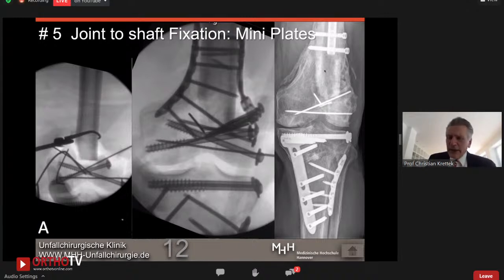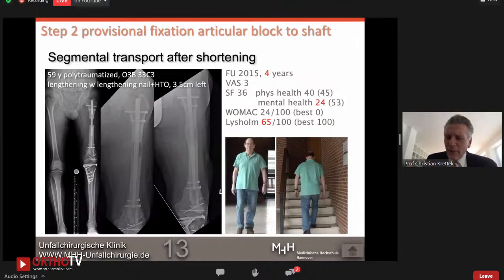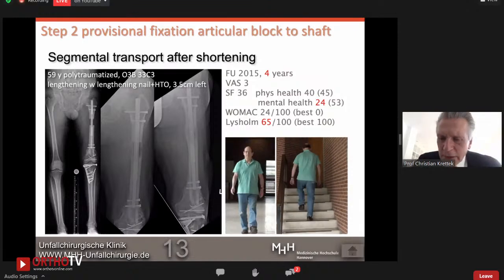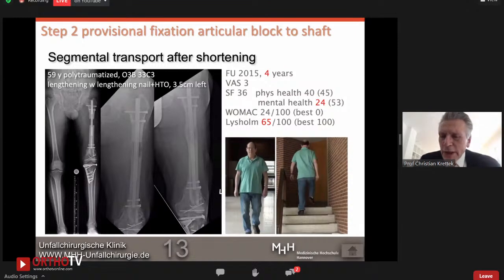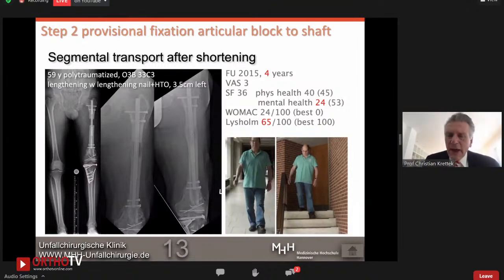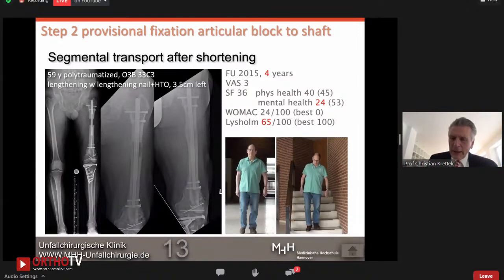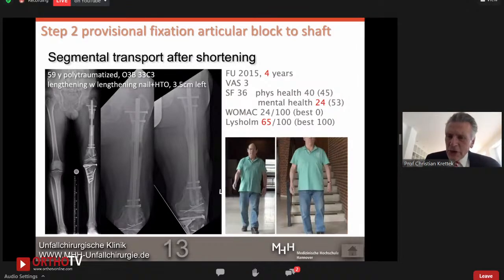And here we see the healing of the case. So medial support in a highly unstable situation is helpful. And here's the postoperative situation. We shortened, but then later secondarily lengthened the patient in order to get him back to his original length.